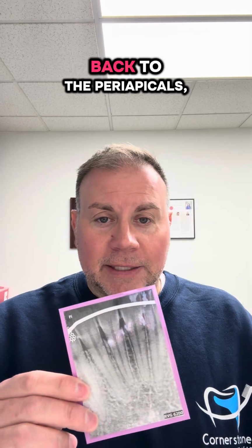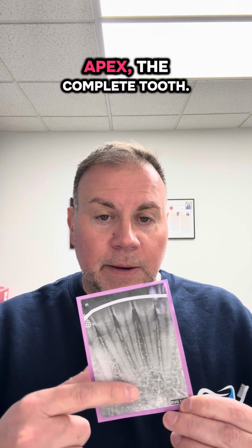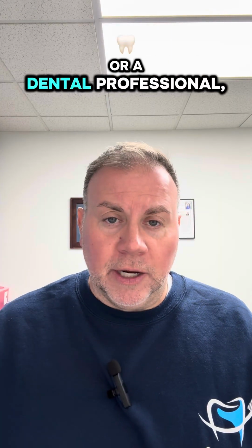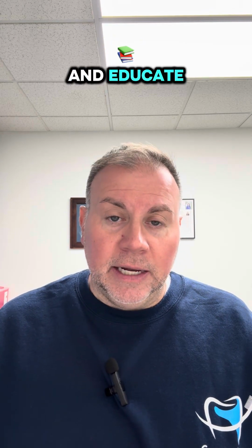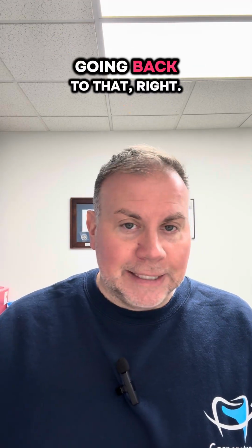So, and then of course, back to the periapicals where we can see the complete apex, the complete tooth. When we take those single x-rays, that's what we're looking for. Now, whether you're a patient or a dental professional, it's always good to understand and educate as to radiation wise. Everybody's afraid of it. You know, I don't want to glow in the dark, going back to that, right?